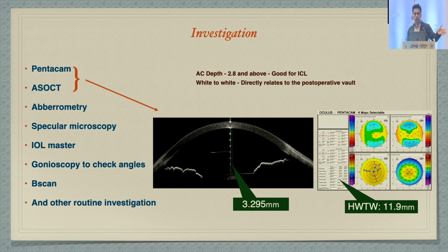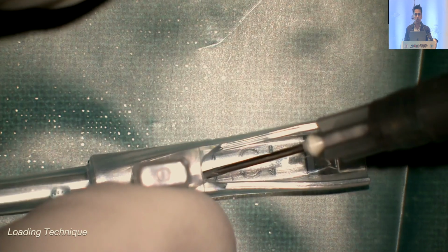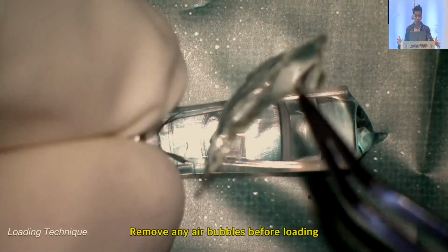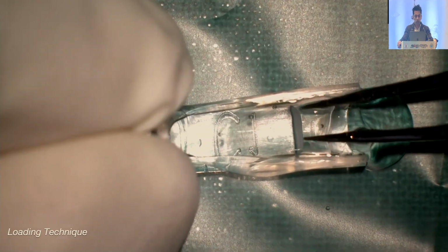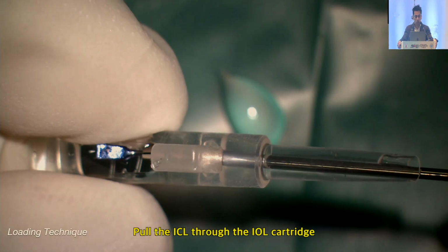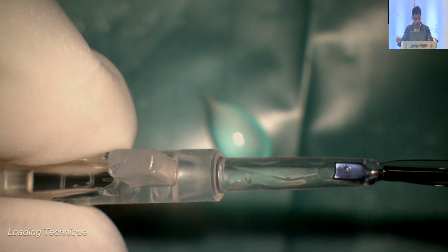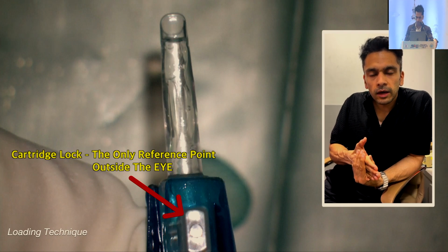If your diagnosis is right, your ICL pretty much goes rather smoothly, except if you have an intraoperative issue, which I'll come to. In the intraoperative phase, the first step is loading. Don't allow the loading to happen by someone else. Do the loading yourself. Ensure that there are no air bubbles in the viscoelastic injection in the cartridge. When you place the lens, make sure that you're concave down and convex up. Holding the ICL and pulling it all the way through is extremely important, but even more important is visualizing the orientation holes through that, outside the eye, as a reference point.